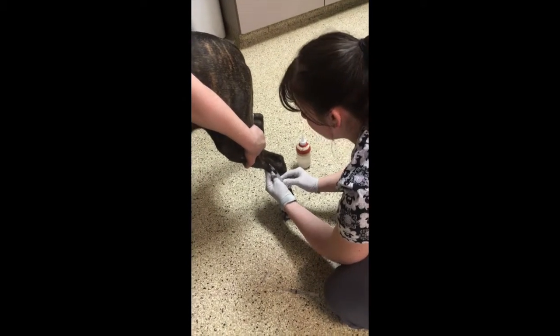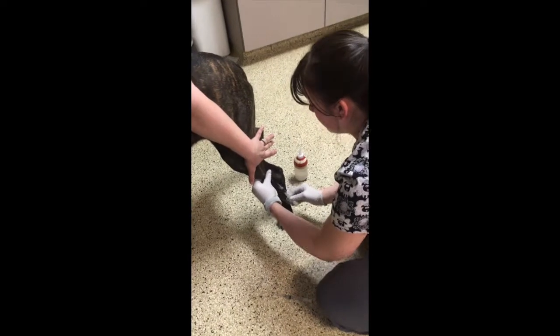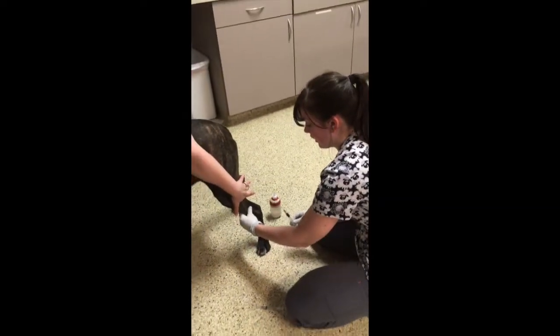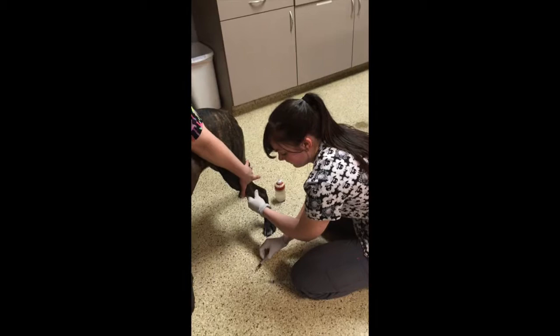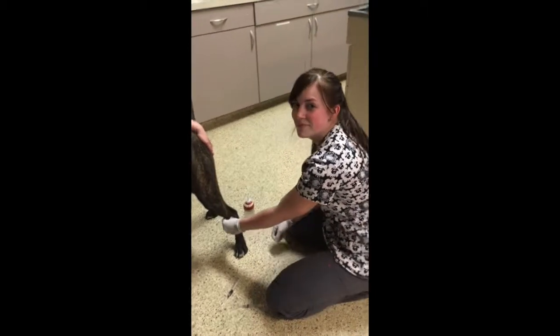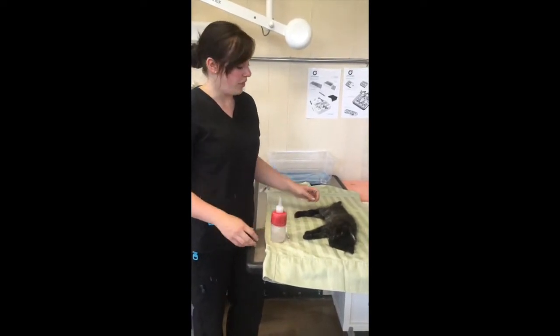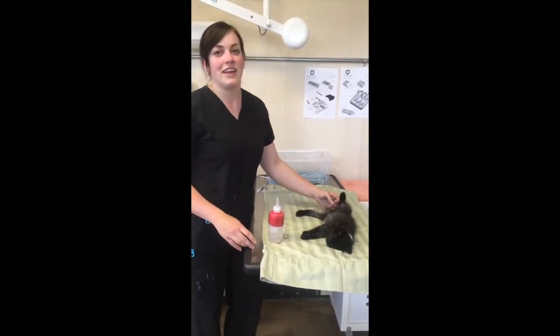Once I've obtained the sample, I'm going to have my assistant release the pressure. I'm going to put my finger over top and hold off for a few seconds. And we're all done. Alright, I'm going to be demonstrating how to draw blood with the medial saphenous vein on a cat.